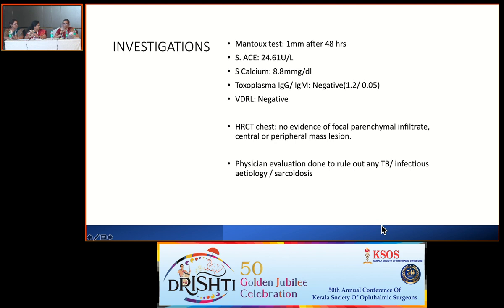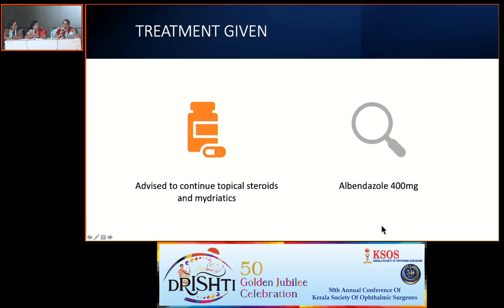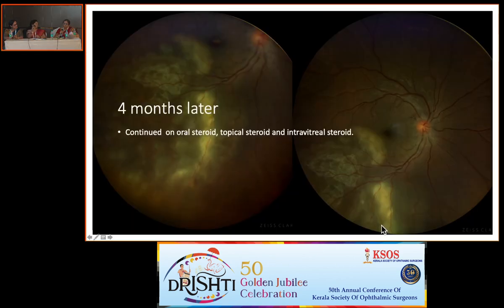It's very commonly mistaken to be either choroiditis. Actually, those lesions are not at the level of the choroid. If you run OCT, it's at the outer retina. Or it's mistaken for vasculitis or neuroretinitis. In that, only one case. You'd better take a fundus photo so that you can spot the worm easily.